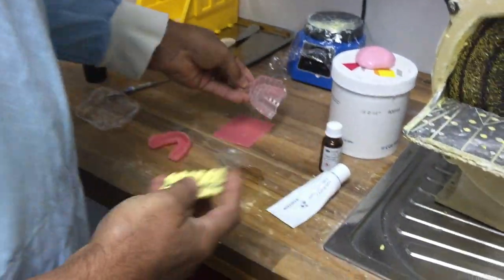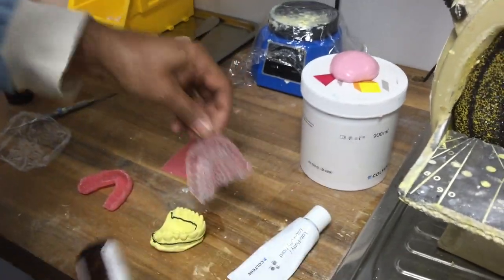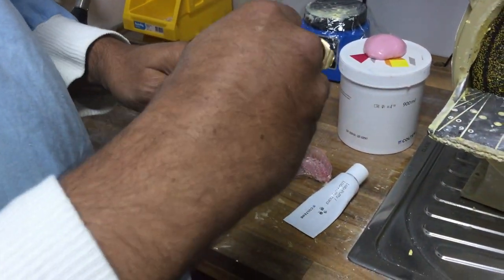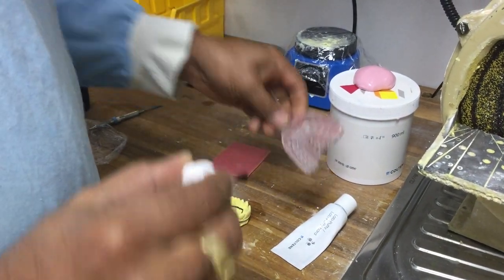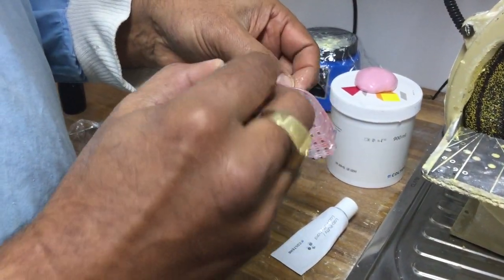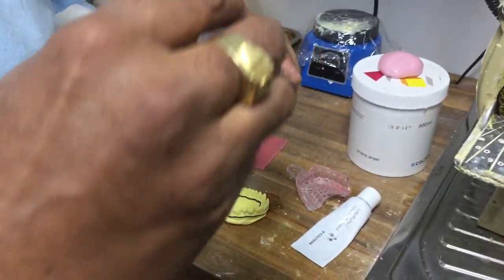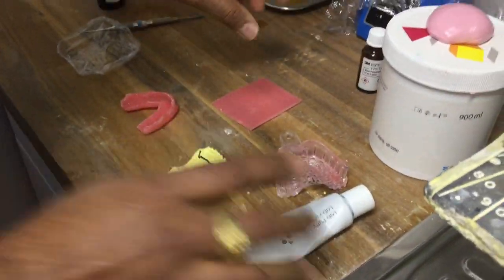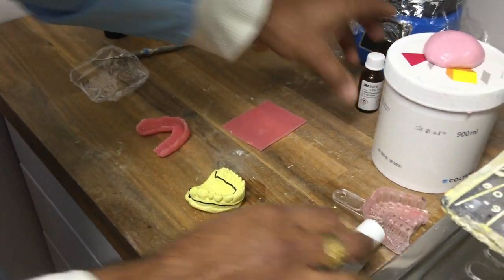With the stock tray, I'm going to put some adhesive. This is a VPS adhesive — we use the matching adhesive. I've done this a little while ago, but you apply it in strokes like that, making sure it's got a good coat of adhesive on it. That's the tray prepared.